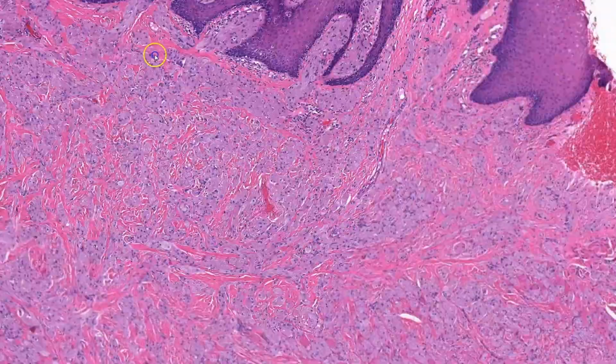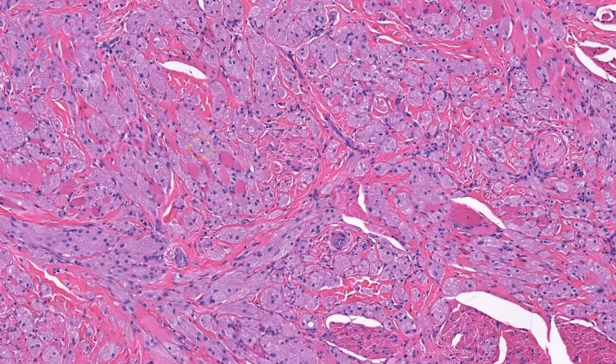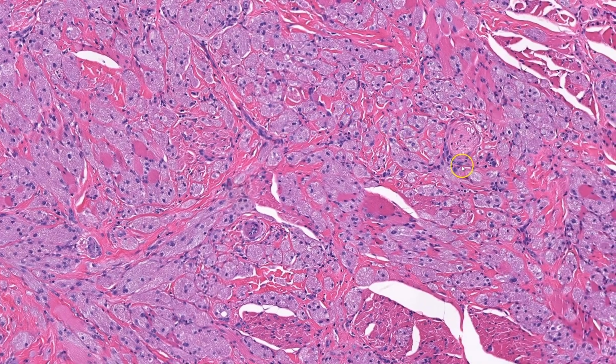Another pitfall for granular cell tumor is its infiltrative growth pattern. As I showed earlier, it surrounds skeletal muscle fibers and even nerves. However, this is not true perineural invasion. It should not cause concern for malignancy.